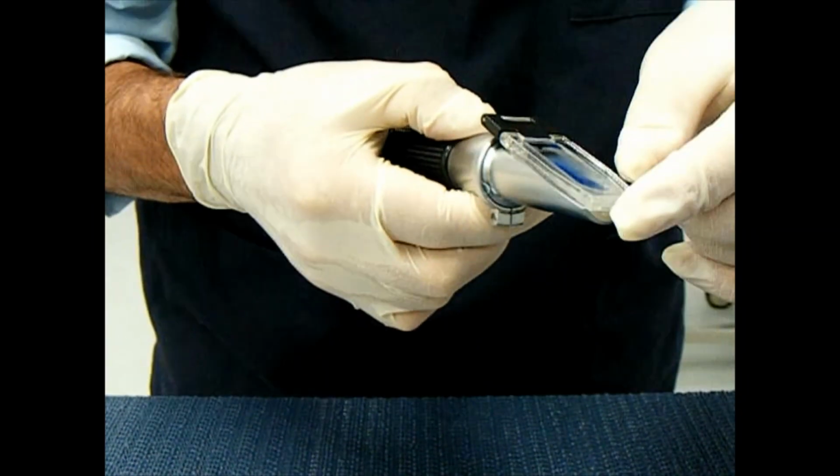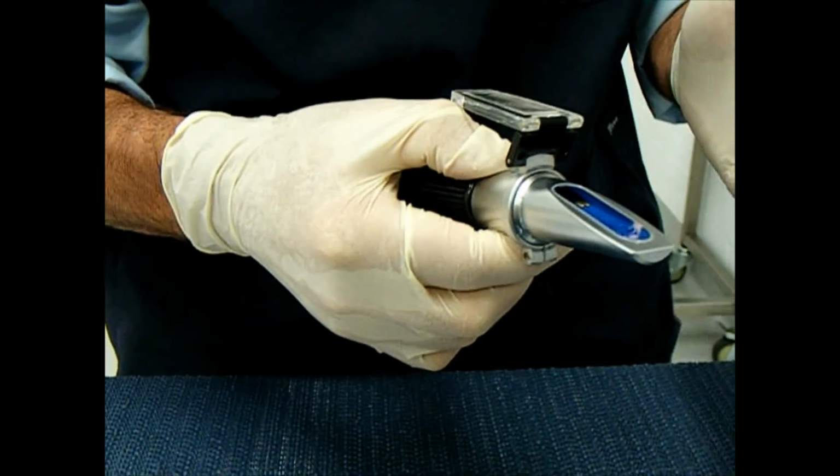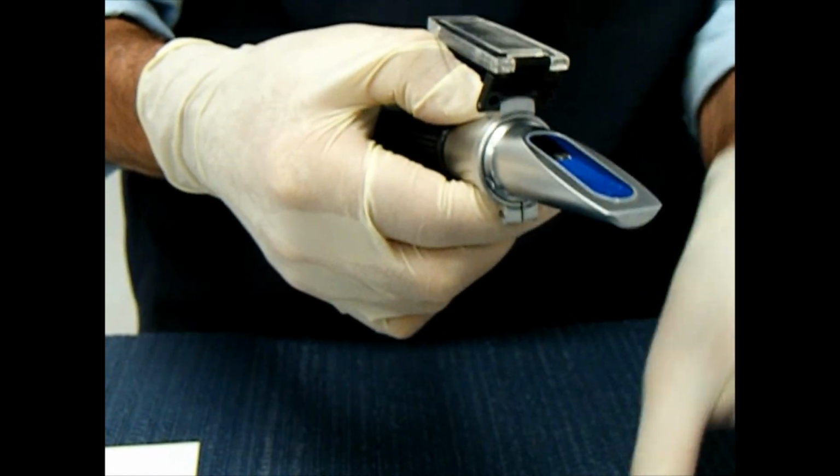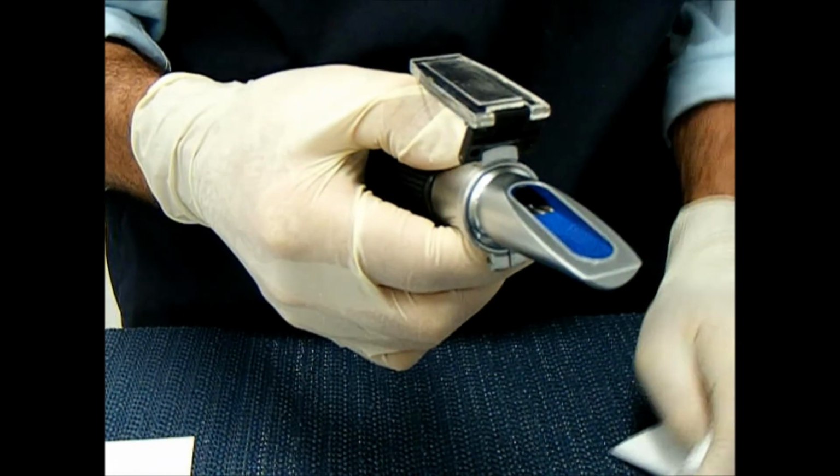At the end, you want to wash this all off under the tap with tap water, dry it with the lint-free tissue and put it back in the container.